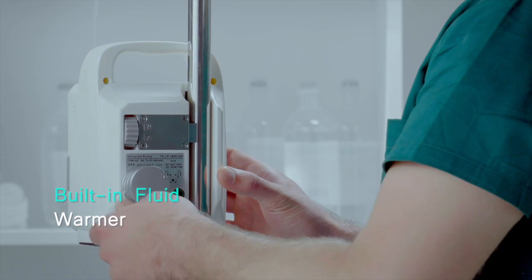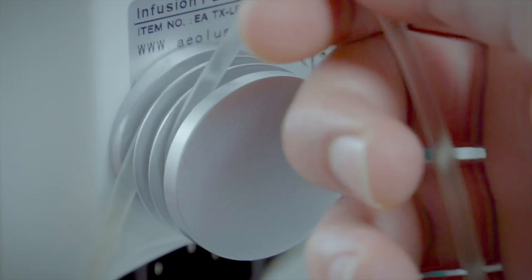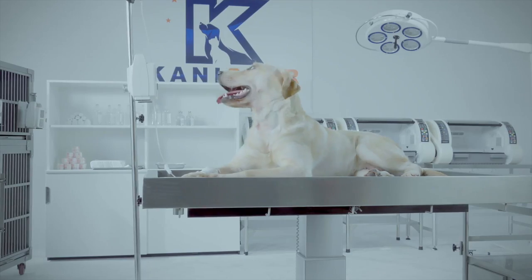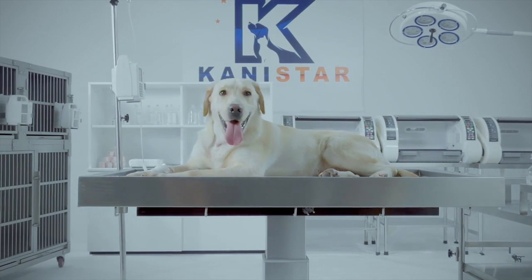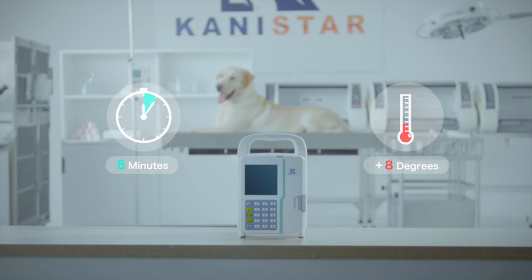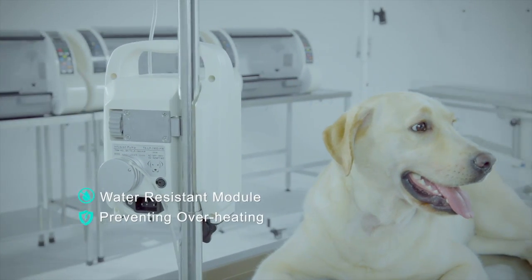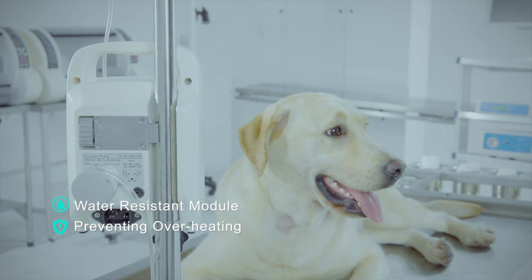Built-in fluid warmer. A rapid drop in core body temperature can cause shivering, wound infection, heart problems, and even death. This warming module is the easiest way to prevent hypothermia in transfusion treatment. Fast and easy to set up, it will heat most fluids by 8 degrees in less than 5 minutes. This water-resistant module is equipped with a built-in detector that prevents overheating, ensuring safe operation.